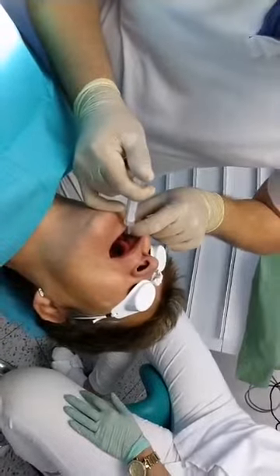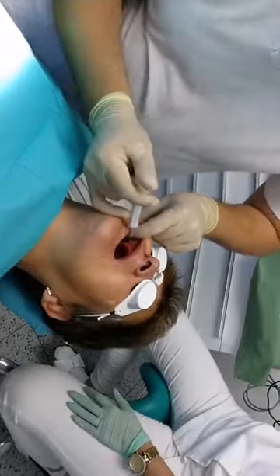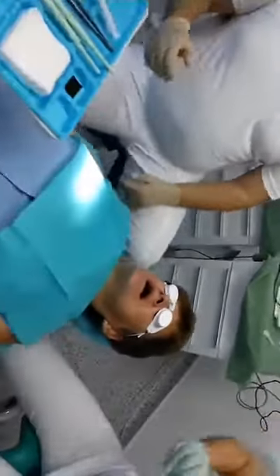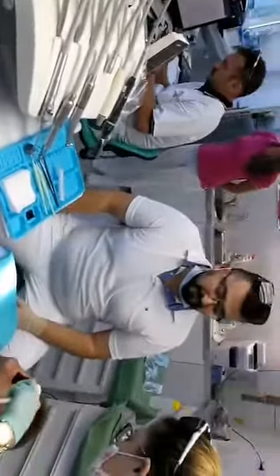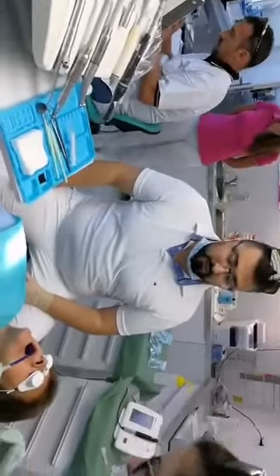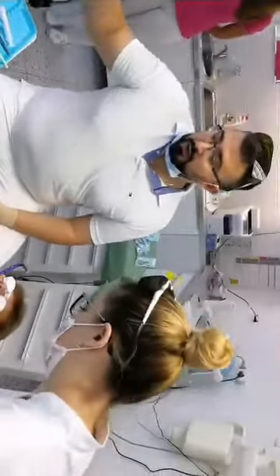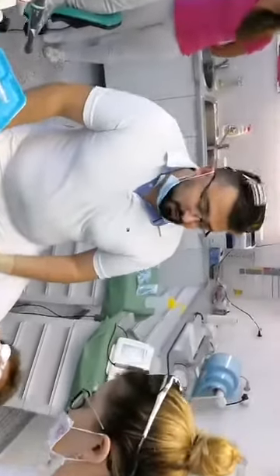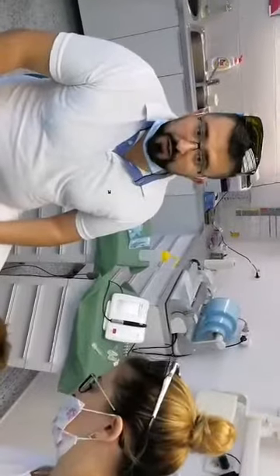We are in Bratislava, in my office in the center of the city. I have more than eight years of experience with dental lasers, so today we will use the Aquamarine. It's a completely new device that is very suitable for surgery on soft tissues.